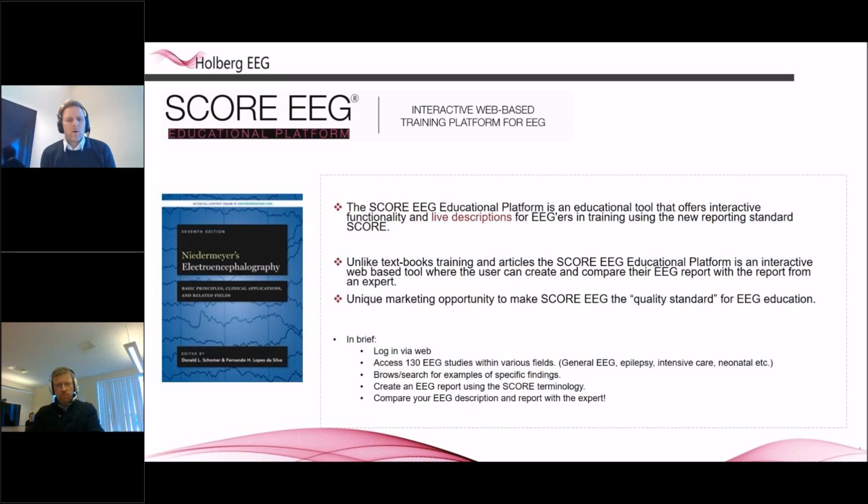You're probably also aware of the Niedermeyer's Electroencephalography book. A new revised version came out late last year, and in this book there is now a full chapter dedicated to describing the SCORE standard. Together with Oxford Press, the publisher of Niedermeyer's EEG book, we have developed an educational platform.